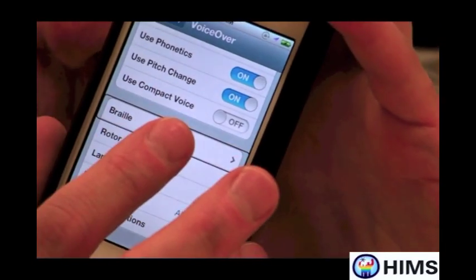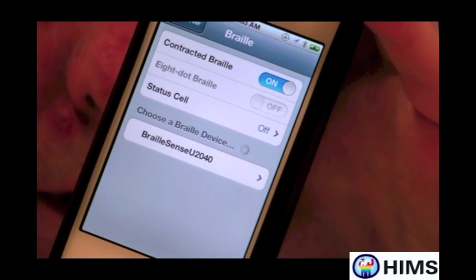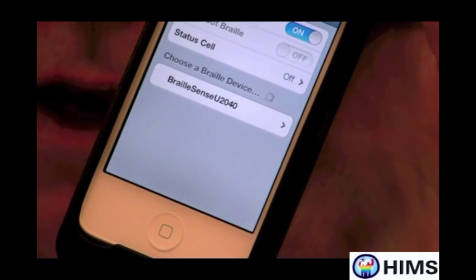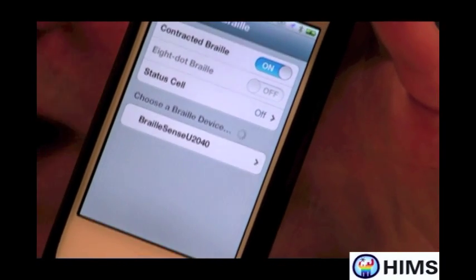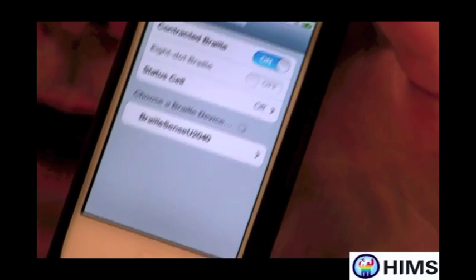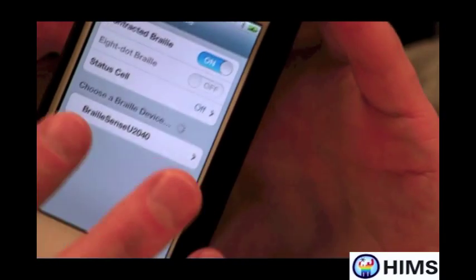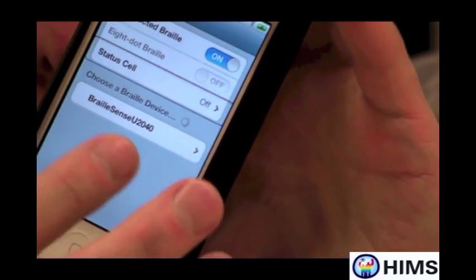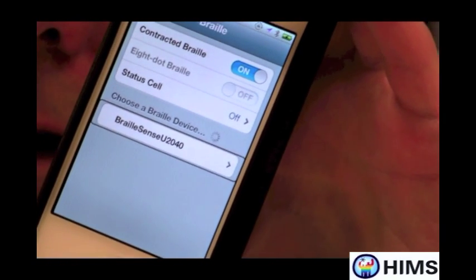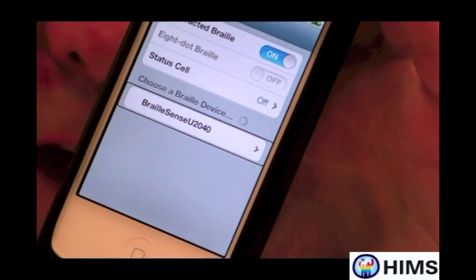I'm going to double tap on Braille. And what's really neat here is I've already made the BrailleSense U2 a discoverable item. So on my screen now I should find the BrailleSense U2. And there it is: 'Braille contracted, eight-dot Braille' — and under 'Choose a Braille device,' it shows 'BrailleSense U2 2040, not paired' as a button.